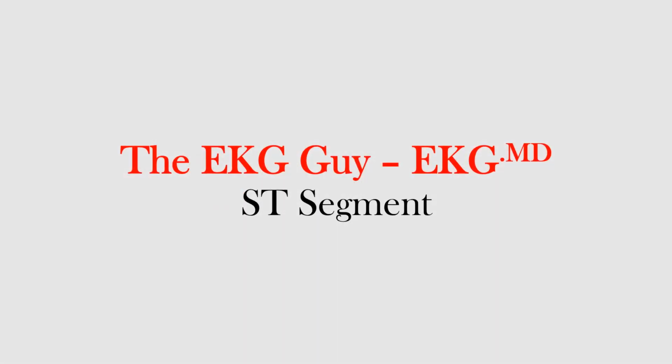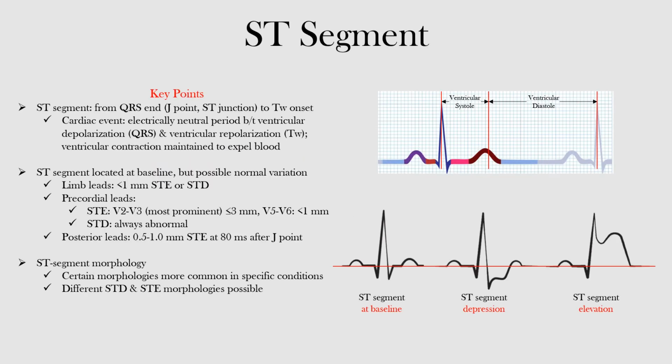In this lecture, we will discuss the ST segment, specifically what it represents and how it should normally appear on the EKG. The ST segment represents the time from the end of the QRS complex to the onset of the T wave. The start of the ST segment is also referred to as the junction point or J point, and sometimes referred to as the ST junction.